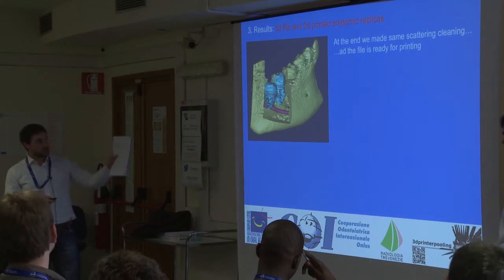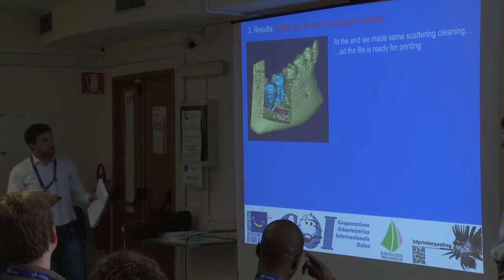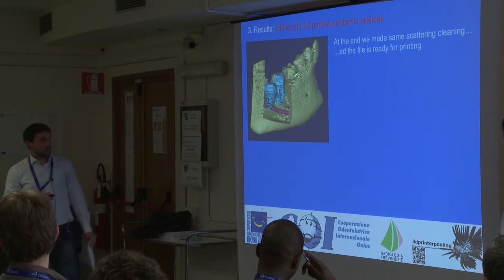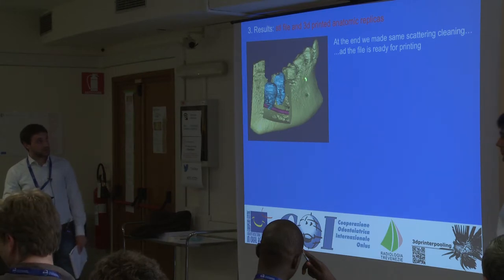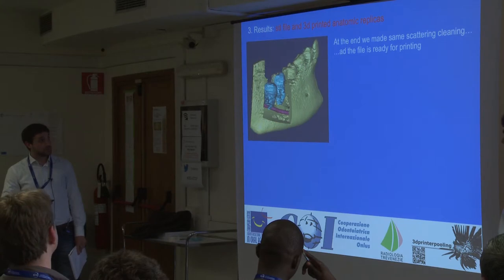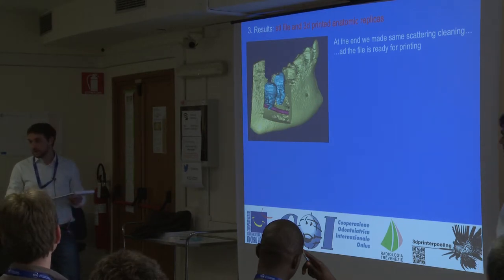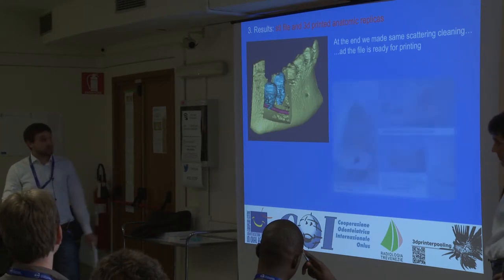With the segmentation, you can select only teeth or only mandibular nerve or the bone with the teeth. You have two choices based on what you want to replicate.